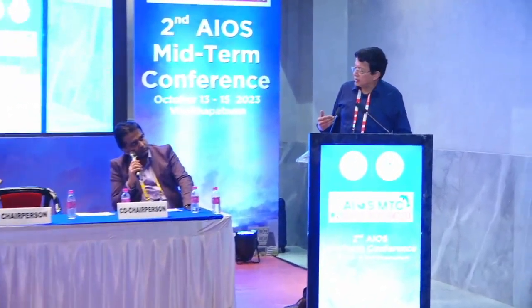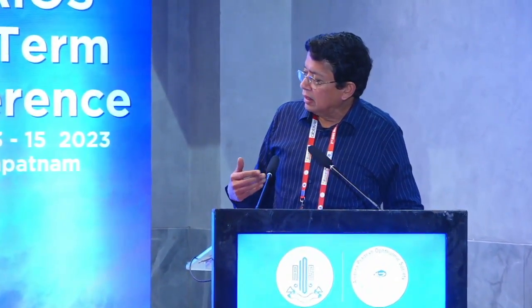But if the patient is somebody in his 60s or 50s who says every day I have to drive back home for 8 kilometers, driving vision is extremely important, because you're never able to predict who are the patients who are going to have this dysphotopsia, then we would counsel these patients, and some of them still choose to go ahead. They say I'll manage, see if it works for me, and surprisingly, many of them do well.